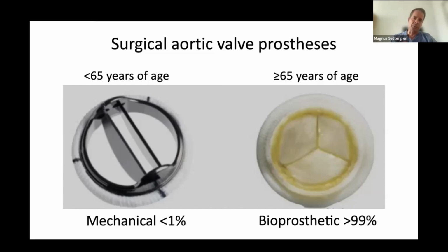And I think it's also important here because we know that this patient will be needing at least one more intervention during her lifespan, hopefully. So it's even more important not to have any type of PPM in these patients, not even moderate, because the second intervention could then be hampered by even a moderate PPM, actually.